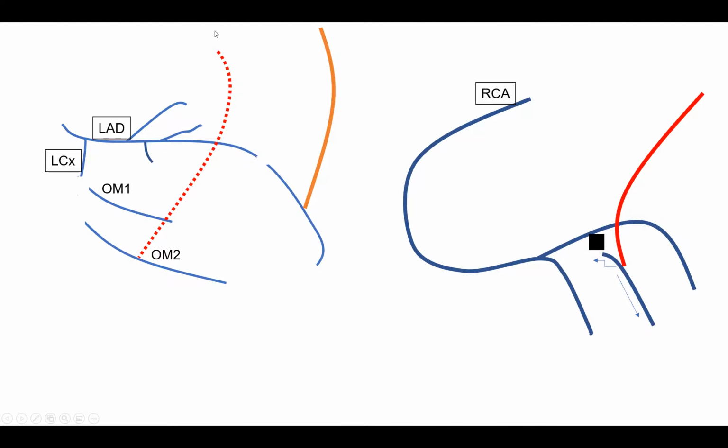He also has, and that's how you should report it. And I see no fellow or no doctor ever reporting grafts this way. That's how I like to report the grafts in terms of territory. So this is how we should report this patient. Number one, LAD system. Within number one, first idea, LIMA to LAD fills the apex antegradally with no retrograde filling. And within that same idea, the proximal portion of the LAD and diagonal are filling via the native vessel with unobstructed flow.